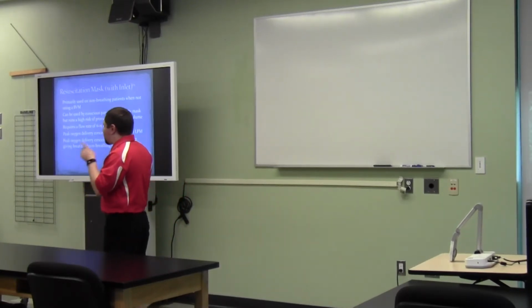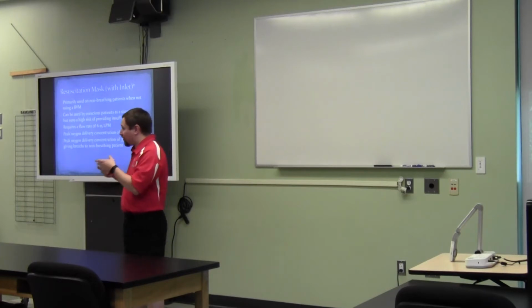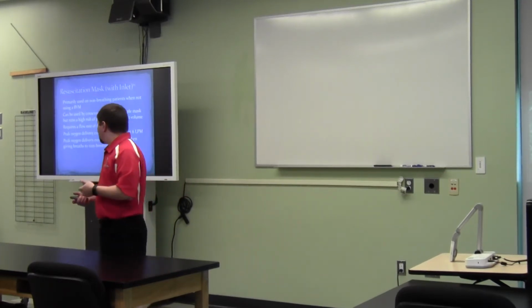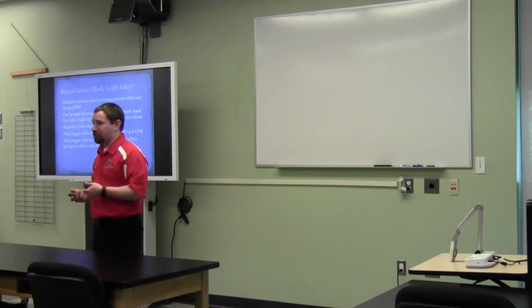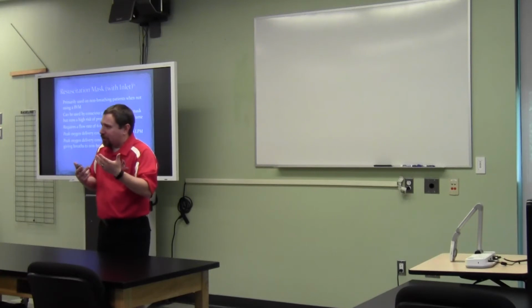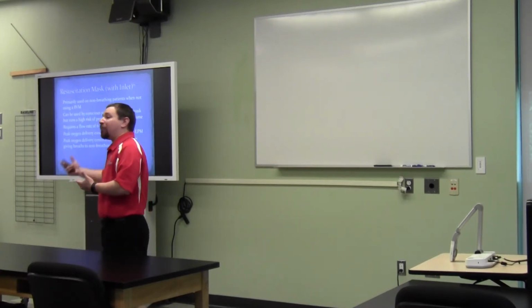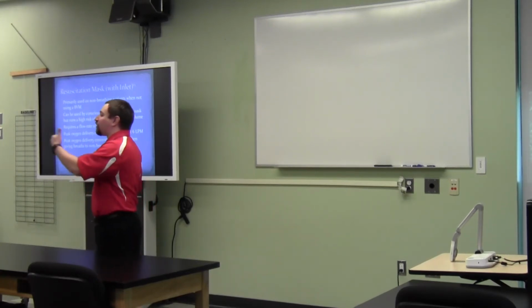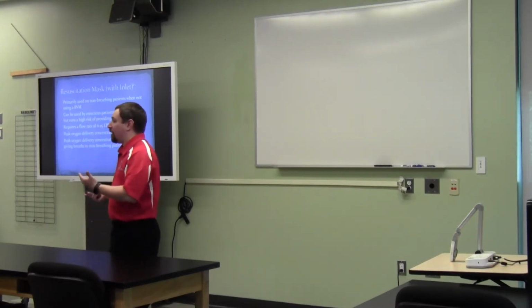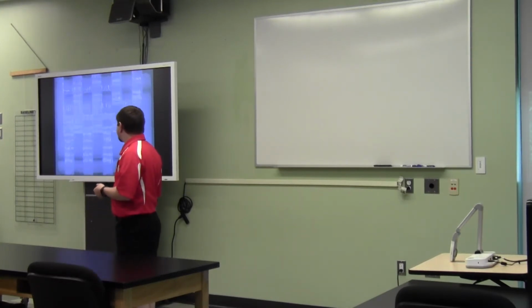But when we're actually using it with our non-breathing patients, giving rescue breaths or giving breaths in CPR, we can actually give about 35% oxygen. Because as we breathe out, we're breathing out a little bit of oxygen, but a whole lot of carbon dioxide. But by adding the oxygen here, we can get them to a little bit higher flow, dilute out the carbon dioxide that we're giving them, and it makes it pretty effective and a nice slow option.